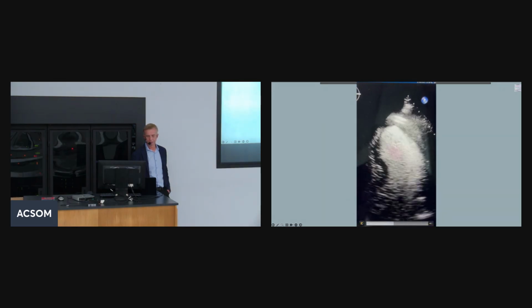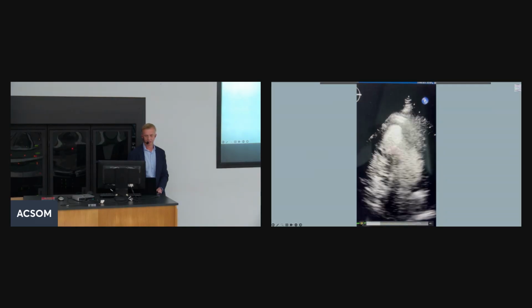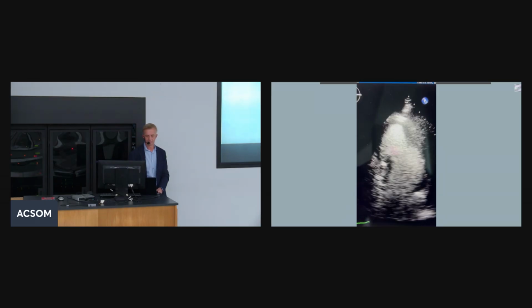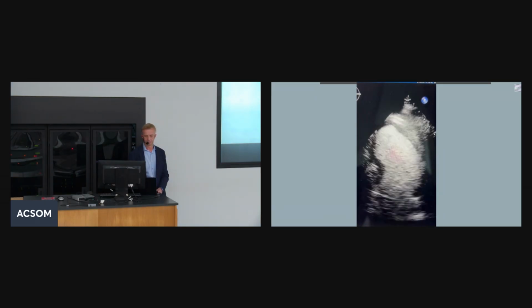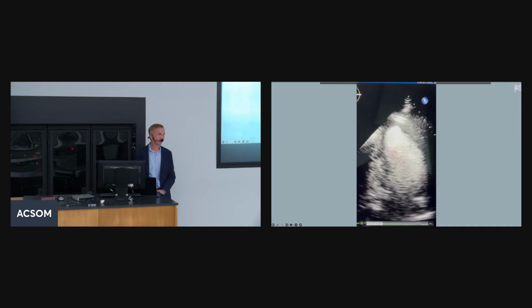Sometimes if we don't have good images without the contrast, we use this white stuff, which is bubbles that reflect the ultrasound waves, and we can see much better delineation of the endocardium. So do you see anything? This is just a little practical thing. Do you see anything abnormal when the heart is squeezing? You don't have to see it.